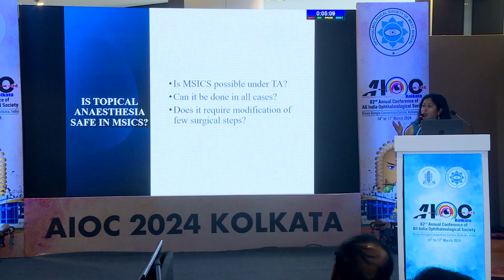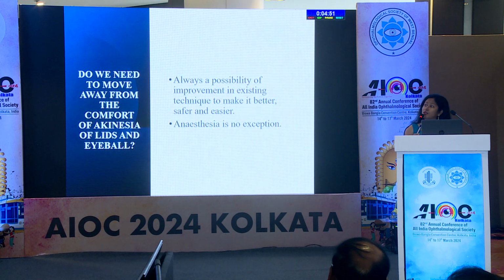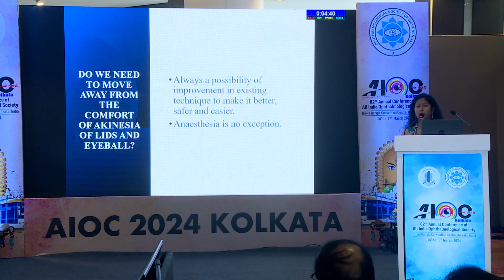Now, is topical anesthesia safe in MSICS? Most of us, I know, are already doing topical MSICS, so this is for the beginners. What are the things that come to our mind? Is MSICS possible under topical? Can it be done in all cases? Do we need to modify some of our steps while doing this surgery? As Dr. Gogte has already mentioned, do we actually need to come out of the comfort zone we have with peribulbar? You have a wonderful anesthesia, so do we need to come out of it?